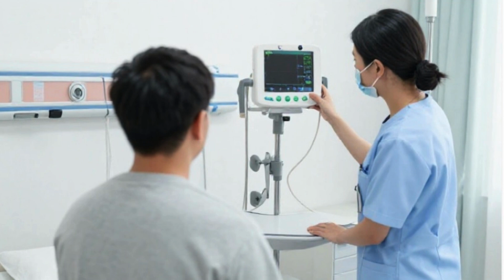1. What is the main purpose of a patient monitoring system? A. To treat diseases directly. B. To continuously observe a patient's vital signs. C. To replace medical staff. D. To perform laboratory tests. 2. Which of the following is not typically monitored by a patient monitoring system? A. Heart rate. B. Oxygen saturation. C. Body temperature. D. Blood glucose level.